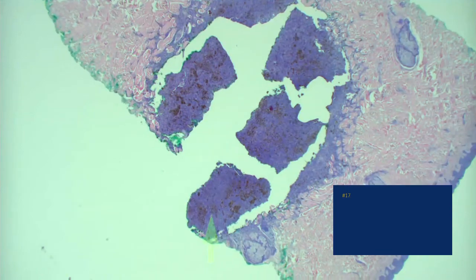Anybody want to give this one a crack? Okay, so this is a punch biopsy of non-acral skin. What stands out is a proliferation in the mid-dermis there. Good. Of these blue staining, but not very dark blue, mostly epithelioid appearing cells. Okay. Maybe a little spindled as well, with a lot of pigment, either melanin or hemosiderin.